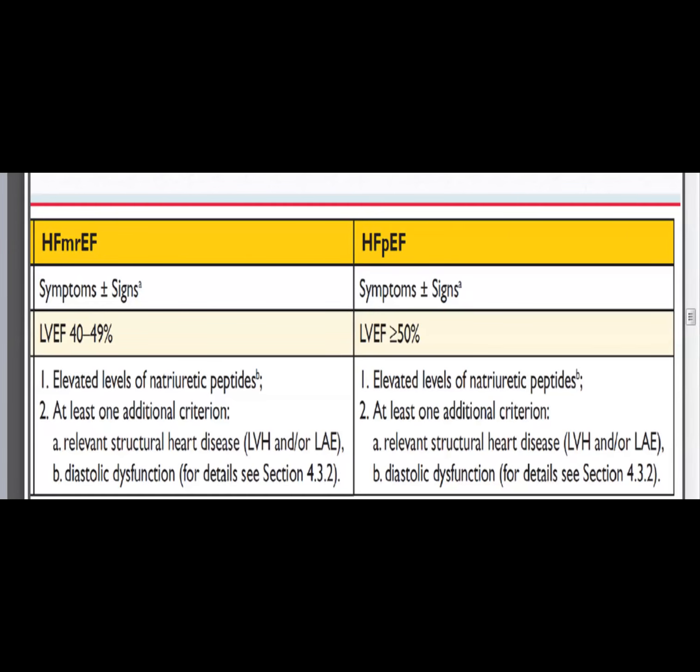We have easily the value of the ejection fraction, the structural disease, and the diastolic dysfunction. So echo gives a lot of information about this classification. So probably you don't need more than echo and BNP and your clinical evaluation. That's all you need for the diagnosis of the 3 forms of heart failure.